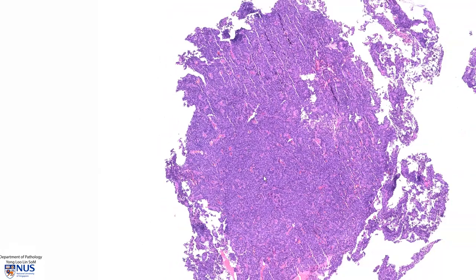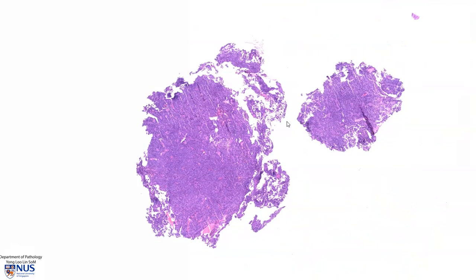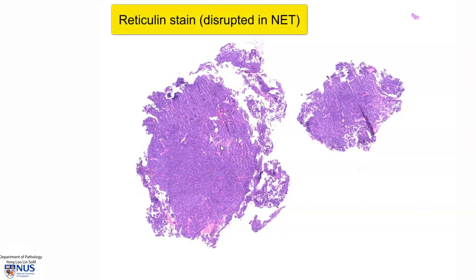Sometimes it can be difficult to distinguish between normal anterior pituitary gland and a pituitary neuroendocrine tumor, particularly if the biopsy is very small and very fragmented. One useful marker or stain that we can do is reticulin, where we would expect a disrupted reticulin staining pattern with much fewer reticulin fibers in a pituitary neuroendocrine tumor compared to the normal anterior pituitary gland, which shows a very nice nested reticulin pattern.